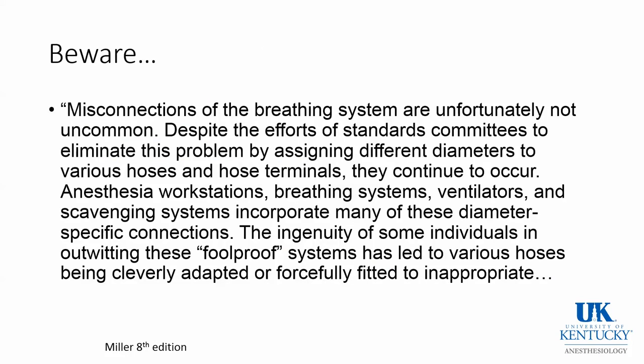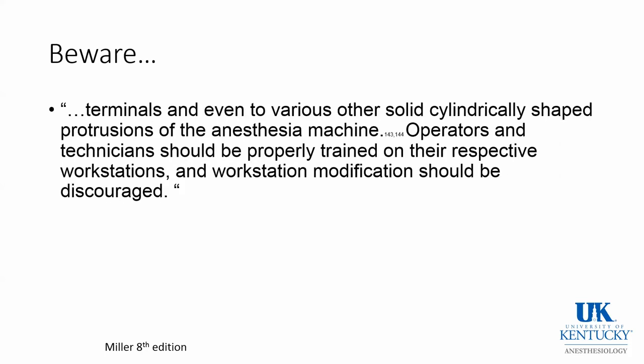Now, this is a direct cut and paste from Miller's 8th edition, and it is mainly a caveat emptor for the end user, and all anesthesia end users should be aware of the fact that the ingenuity of some individuals in outwitting foolproof systems can lead to dangerous anesthesia machine modifications.